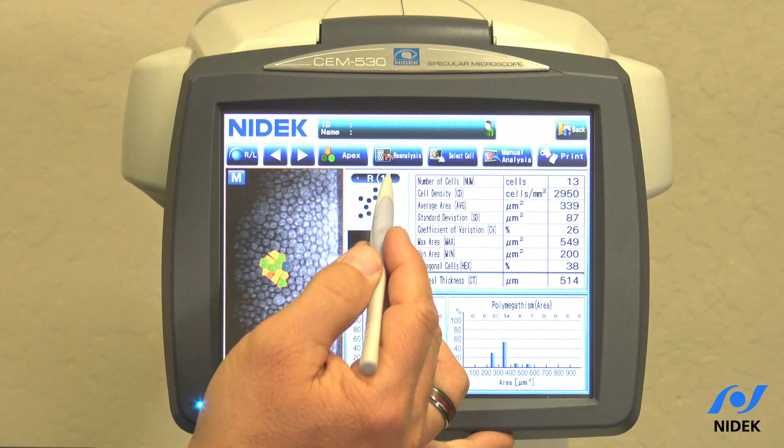Over here on the analyzed table we can see the number of cells that were counted, what the cell density is, and what the average area of endothelium that was analyzed, and the standard deviation of the analysis.